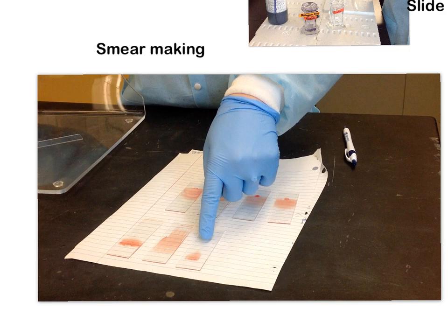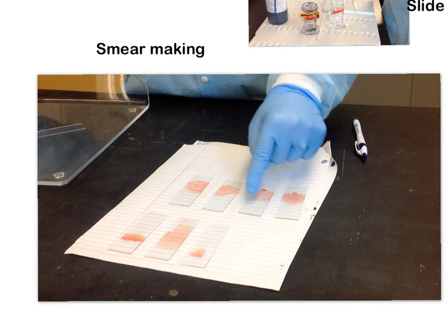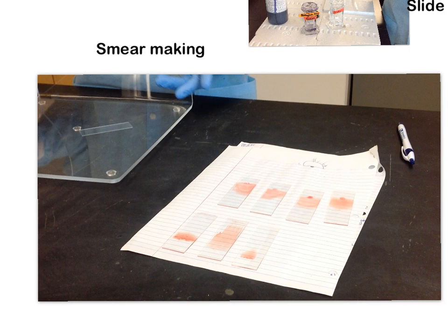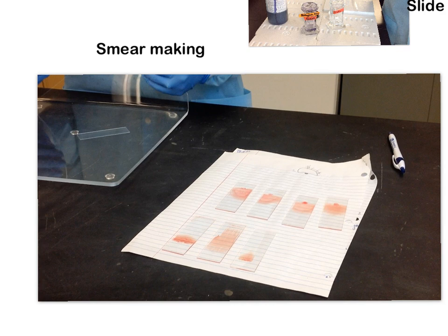Remember, we're looking for that nice feathered edge — no comet-like tails and no flat tops. You'll probably make about 60 smears today, and probably three of them will be good. Don't be alarmed — that's how you learn. Making bad ones teaches you how to do it incorrectly so that you can then do it correctly.